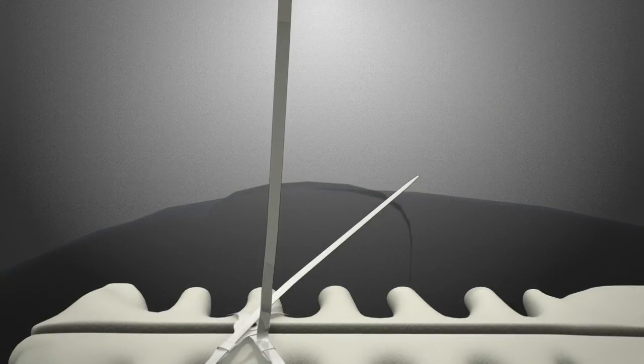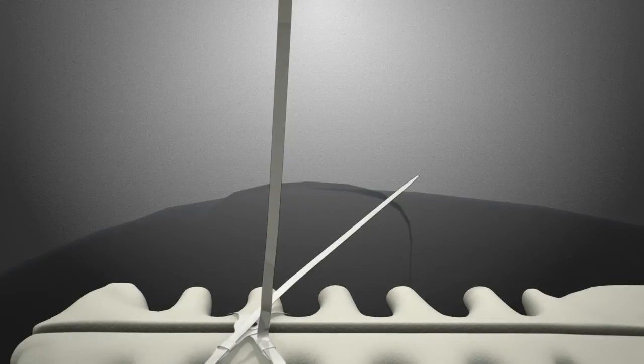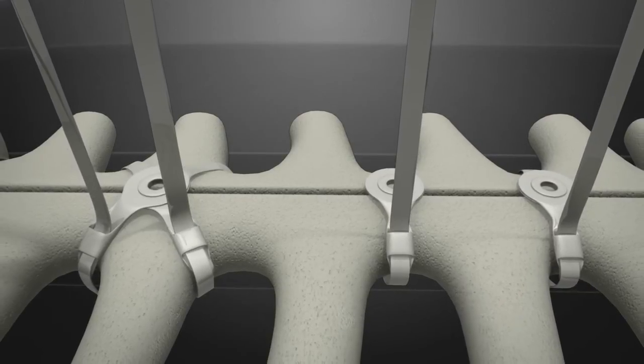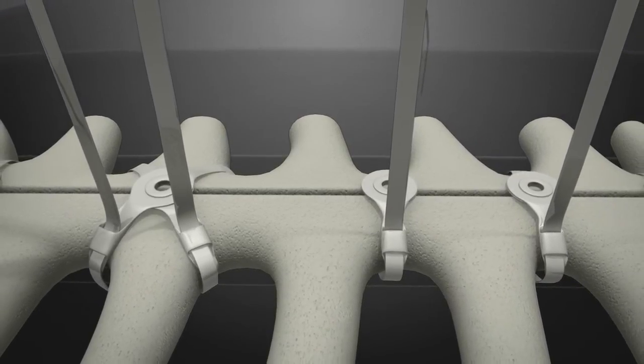This action holds the tension on the sternum while tension is given to the other straps. This method serves to distribute the force of closure across the sternum, much like tightening the lug nuts on a wheel.